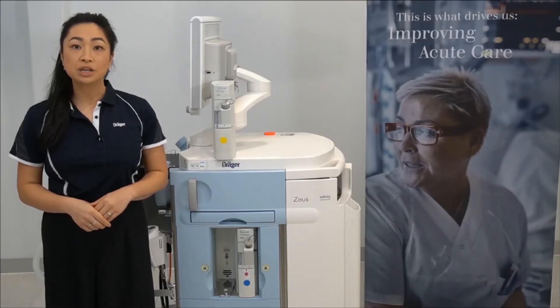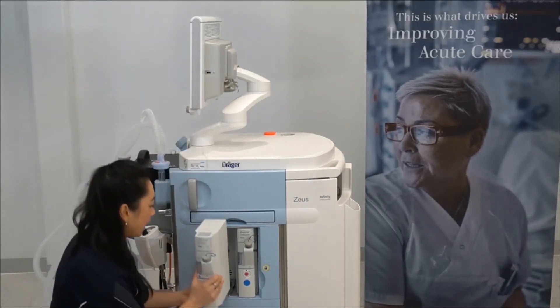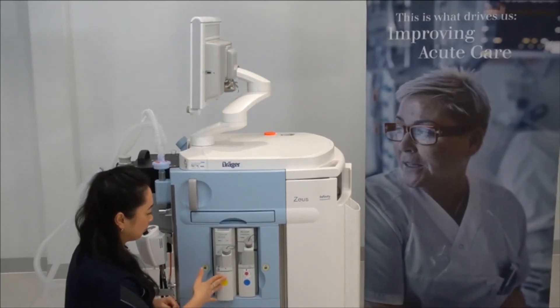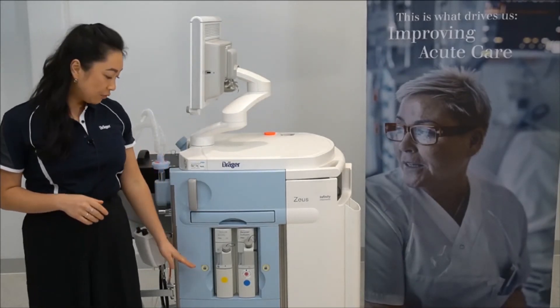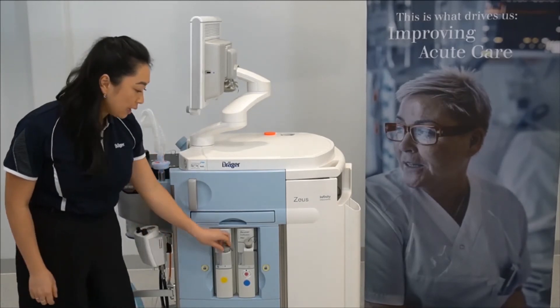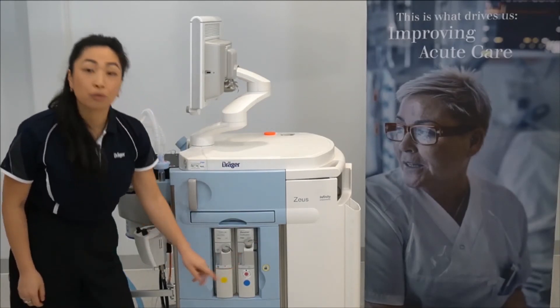To insert the DIVA metering modules, place a firm grip on the module and slide it into the slot until you hear a click. The selection of the slot is arbitrary; however, DIVA one will be your default anesthetic agent. Then ensure the filling caps are properly on and check the fill level through the sight glass.